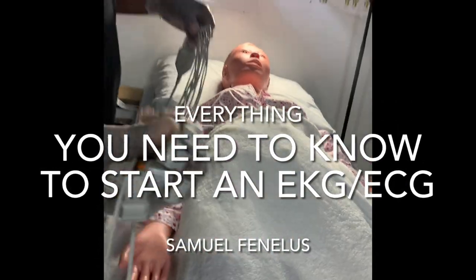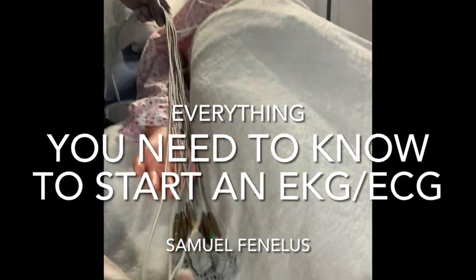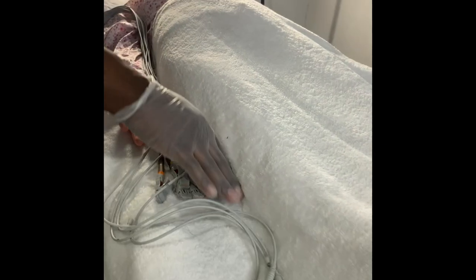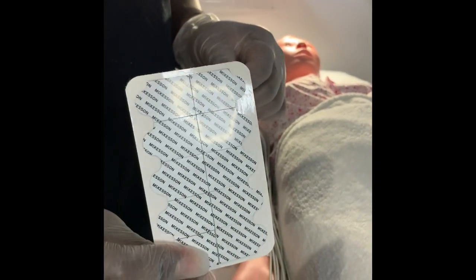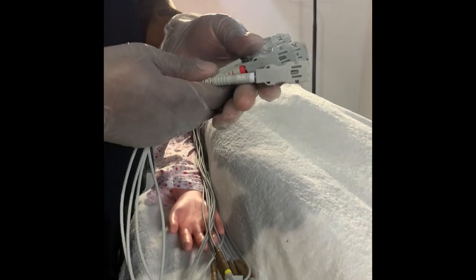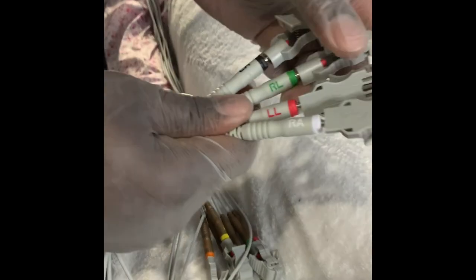I have my leads — the leads are the wires. And then I have my electrodes, which is extremely important, which you need to place on a patient. One thing you need to know about the leads is they're labeled, and the labels let you know exactly where to place them.